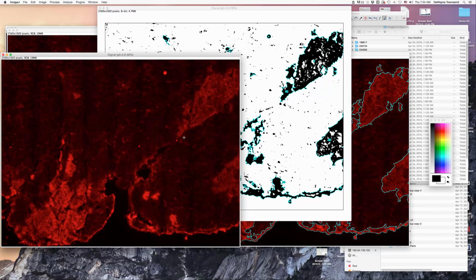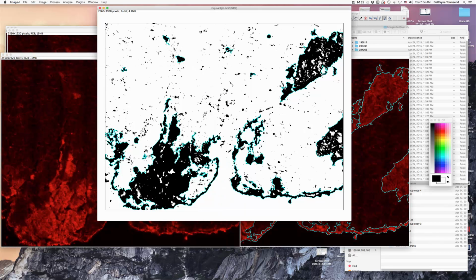This should all be one kind of biggish lesion. When we look at this, you can see it's sort of cut in various spots. We can include these little spots within the lesion area. So yeah, this should probably be included. What I'm going to do is come back in through here and draw a line through there to make sure that area gets included. We decided that this was going to be included too. So that's good.